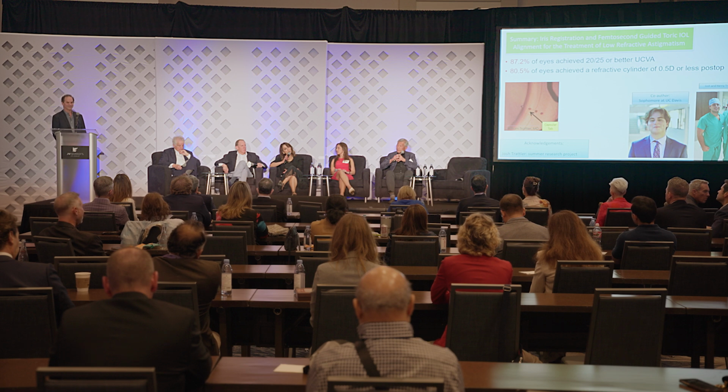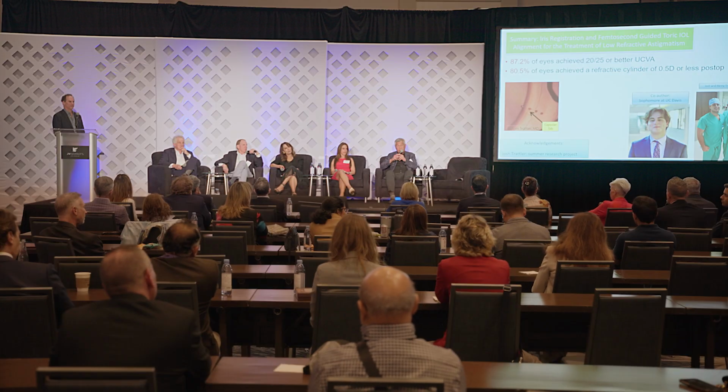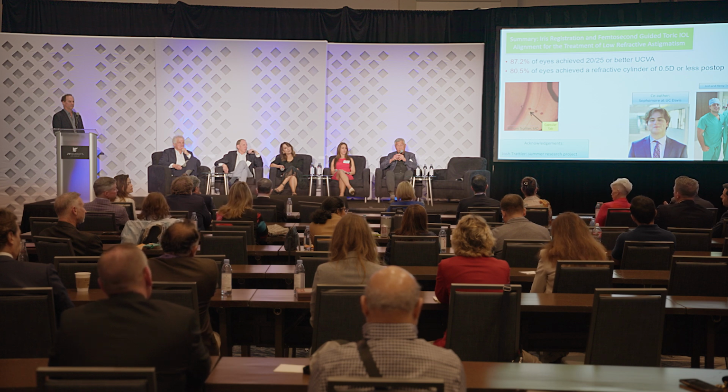And can I ask you, when you are treating the against the rule with limbal relaxing incisions, are you putting your main incision superiorly or are you on axis? No, with our formula, we always require the incision to be either exactly at 0 or exactly at 180. And that's actually marked on the Ally. And now you can actually have your frag pattern aligned with the 180 and 90 if you want. So I actually use the frag pattern to line up my incision.